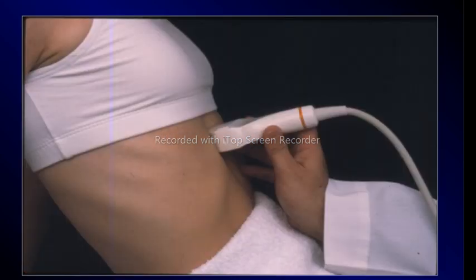Asaf, about pleural effusion, fluid appears dark on ultrasound. So any fluid above or superior to the level of the diaphragm should be within the thoracic cavity, and that is assumed to be pleural effusion. Fluid below, or inferior to, the level of the diaphragm is assumed to be intra-abdominal fluid, and that would be ascites.